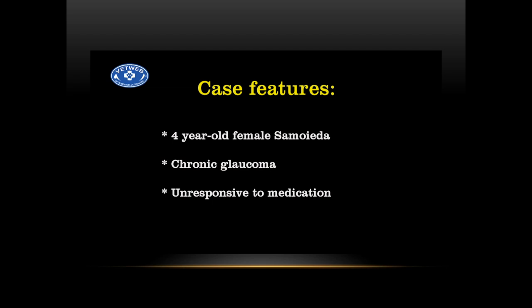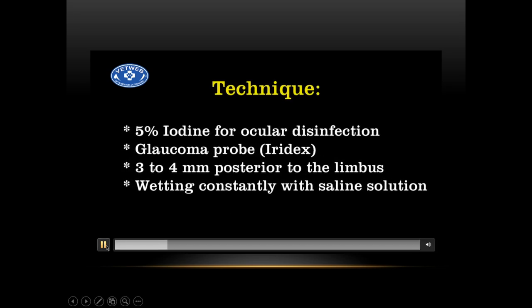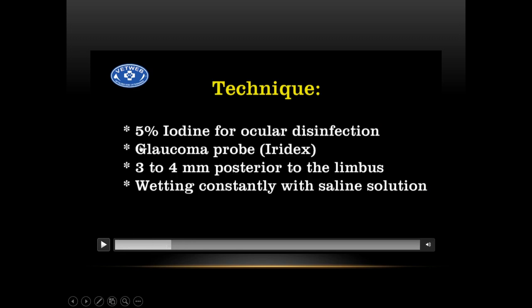So the video is of another dog, a 4-year-old Samoyed, just to show you guys the technique. For the ocular disinfection, use 5% iodine. The glaucoma probe is from Iridex. The technique is you burn the ciliary body 3 to 4 millimeters posterior to the limbus, and you have to constantly wet the cornea with saline solution, because the laser burns and it gets hot. Okay.